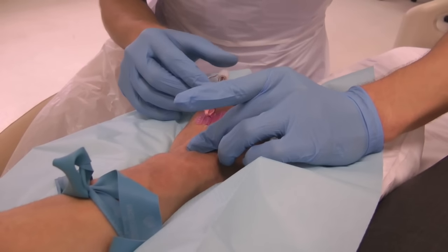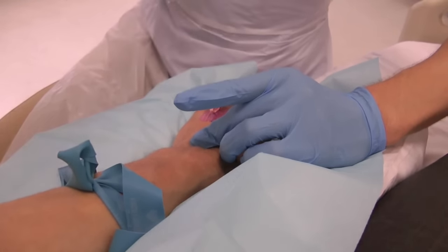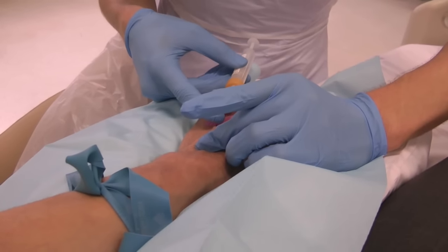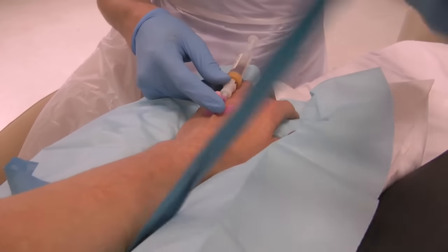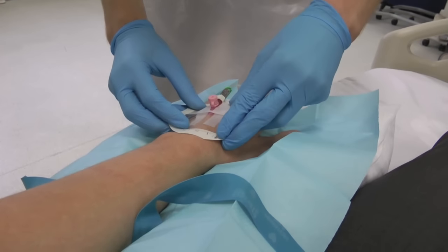Occlude the cannula with your finger to remove the needle. Insert blood bottles with adapter if necessary. Release the tourniquet. Flush. Secure and apply a dressing.